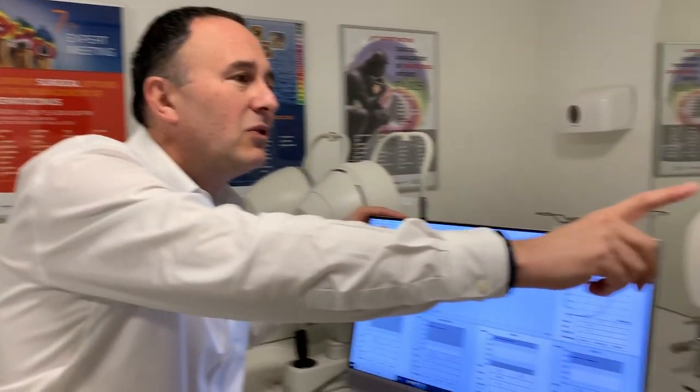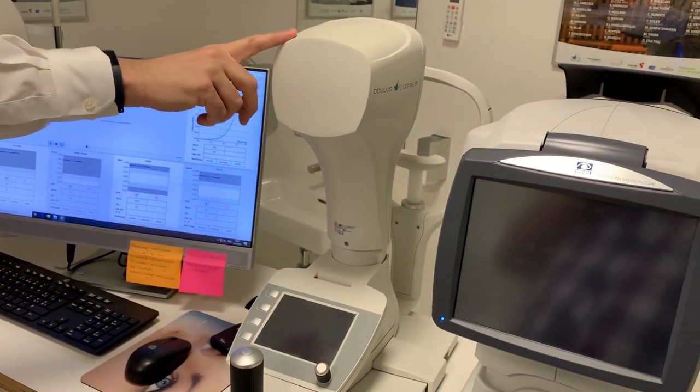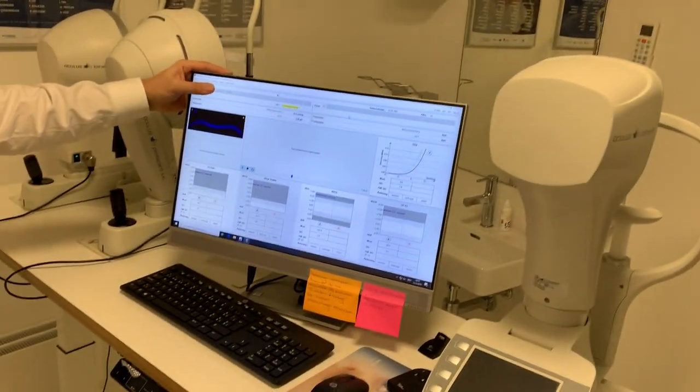In fact, keratoconus is a disease of the tissue. The tissue is too soft, and crosslinking makes it stiffer. Until now, we could not easily measure that. But now we can. This is the Corvis from Oculus, and the Corvis is a device that directly measures biomechanics.